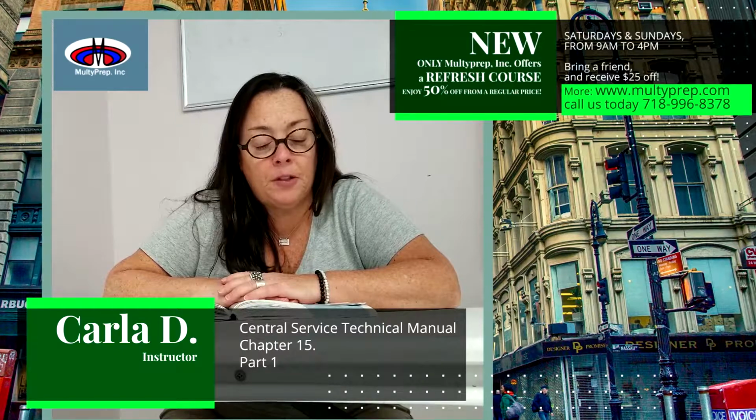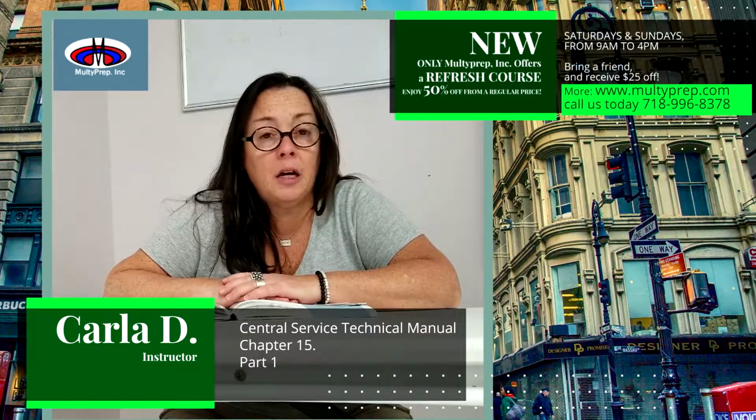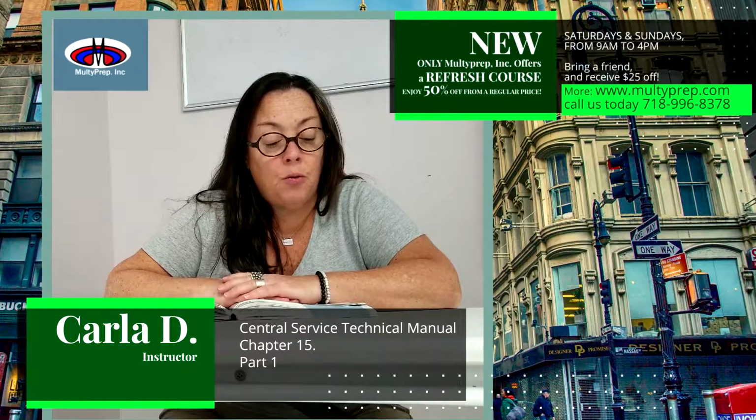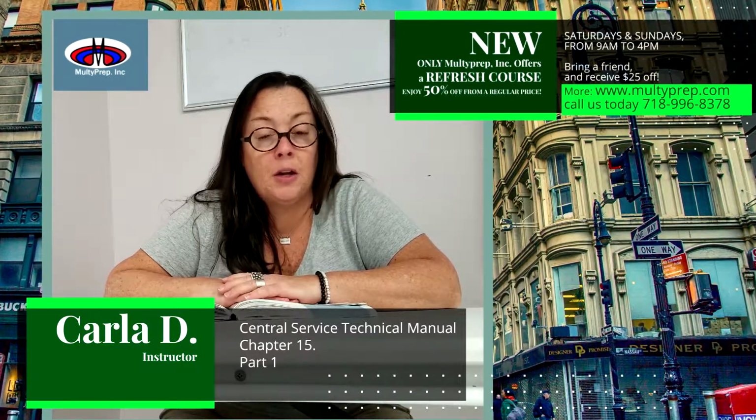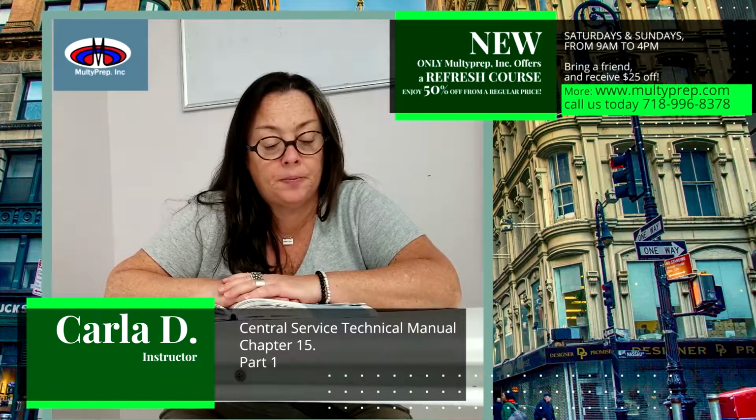Introduction. Low temperature sterilization has become increasingly important due to the development and growing use of delicate, heat and moisture sensitive medical devices and surgical instruments. Ethylene oxide, or EtO, hydrogen peroxide, or H2O2, and ozone, O3, are low temperature sterilization methods commonly used in healthcare settings, and each provides terminal sterilization.